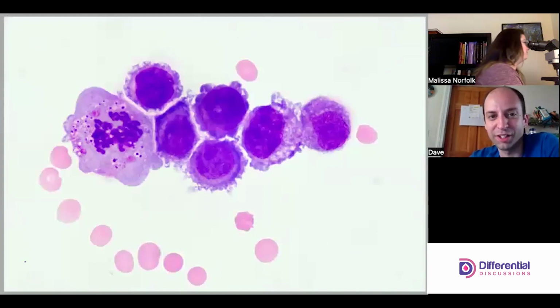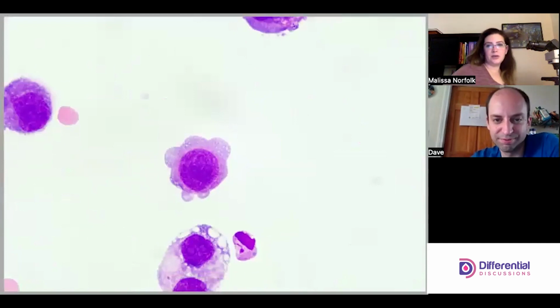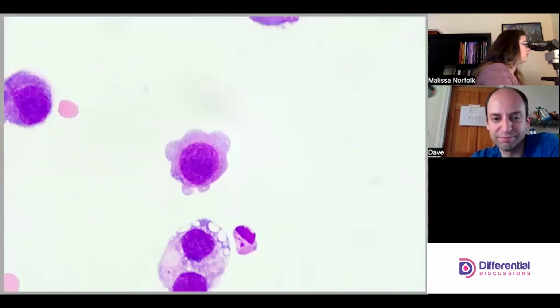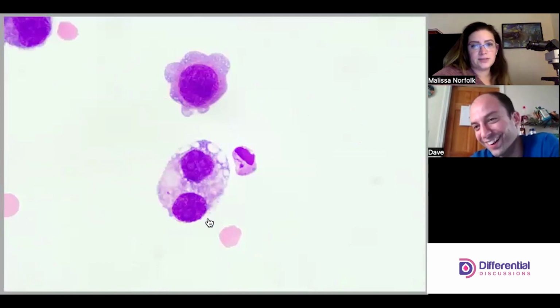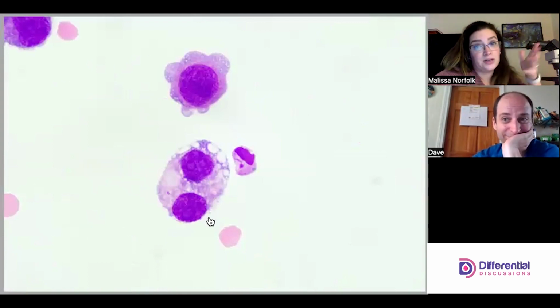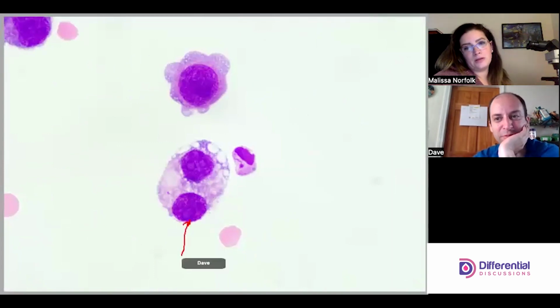Yikes. More mitotic figures, more ugly. These guys up here, let me pull them in a little better. This one is hard to tell if it's a binucleate cell, just got two nuclei in there, or if this is two separate cells, because you can't see where the cell ends and cytoplasm begins. Look at the gargantuan one. I don't know what we call it. And how about this one? Ridiculous.